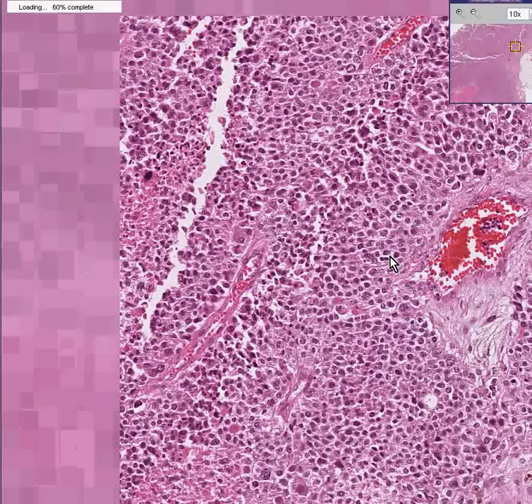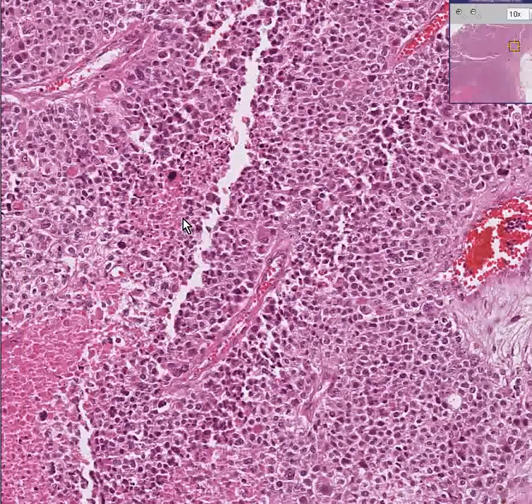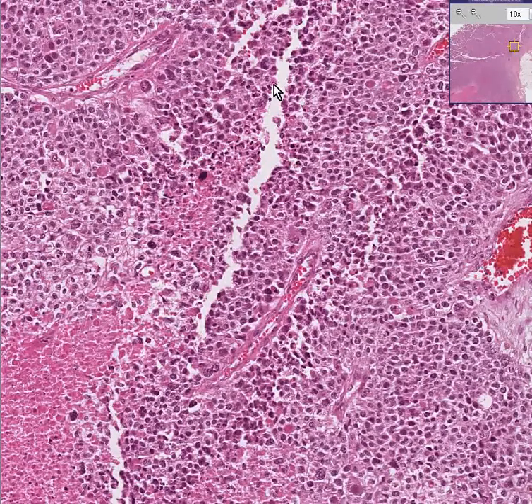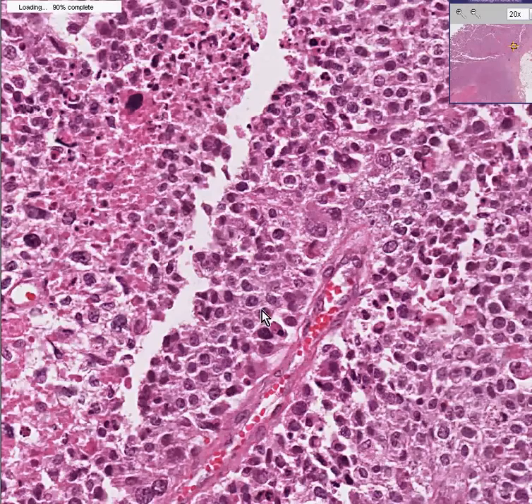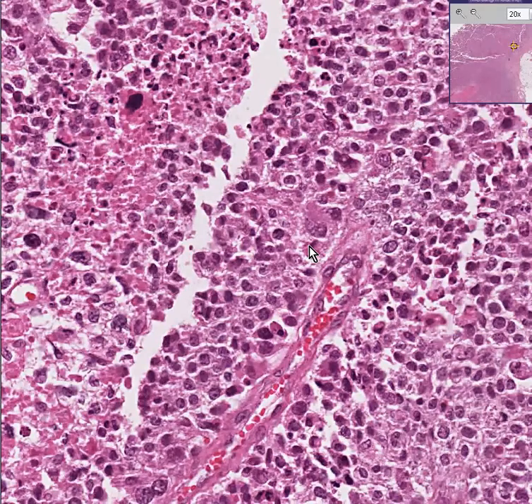Also note, once again, the extreme pleomorphism of this tumor and the areas of necrosis. As these tumor cases roll on, I think you will have a good feel for just looking at tissue that seems to be unorganized, necrotic, and occasionally having large, bizarre nuclei as being just instantly malignant tissue, no matter what the source is from. This is an adrenal cortical carcinoma, and thank you very much.